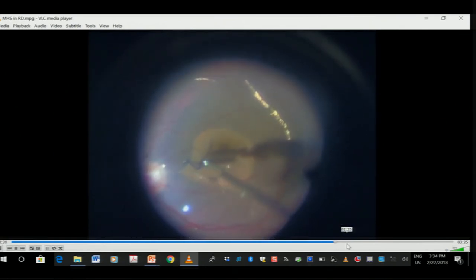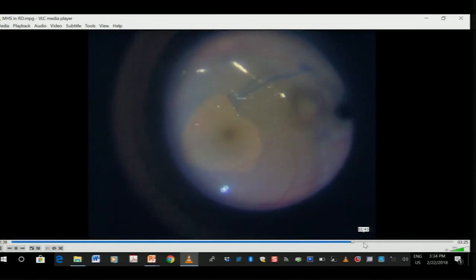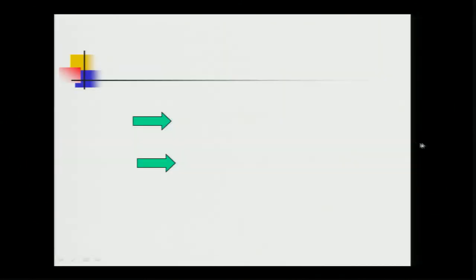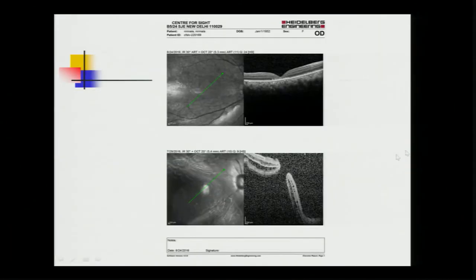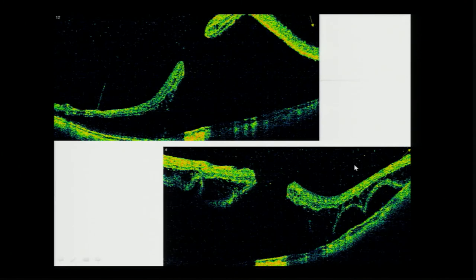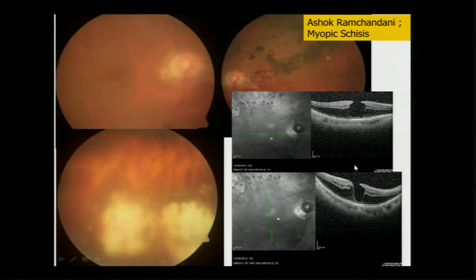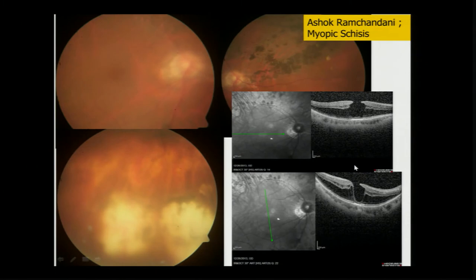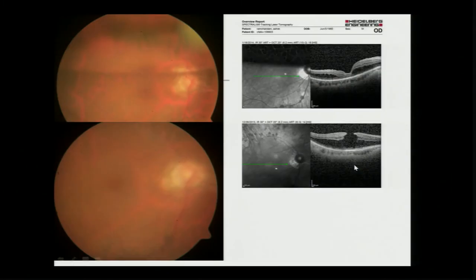The feel, as I said, is slightly different and you can peel ILM till whatever you want. You see, once you start peeling, you really start enjoying this peeling of ILM, and take it away. And then you do usual exchange as you do in any VR surgery. This is the result of the same patient where we see this macular hole, and a couple of more patients. This was a patient of schisis actually, where we use this similar technique, ILM peel.